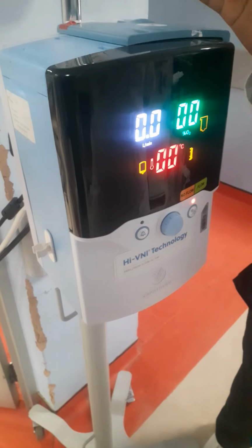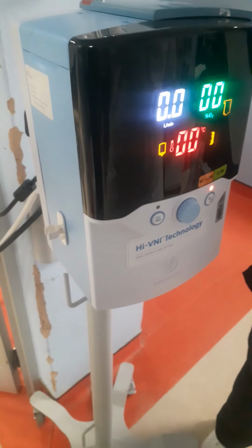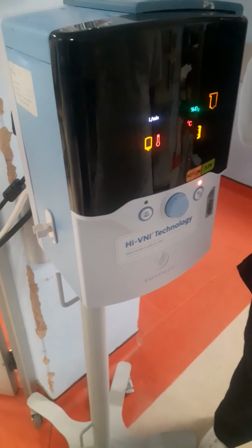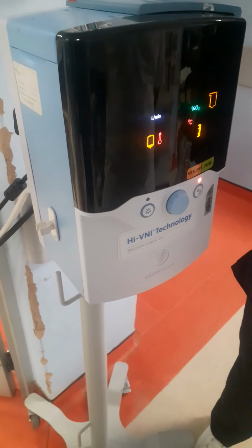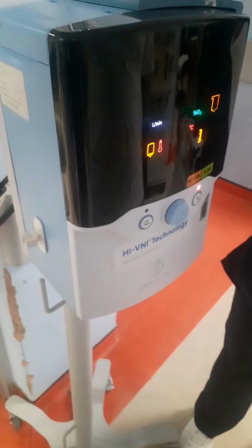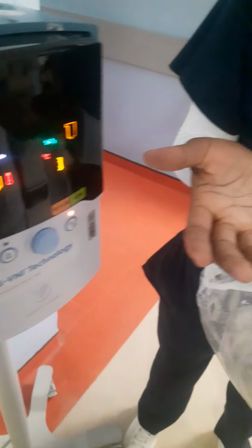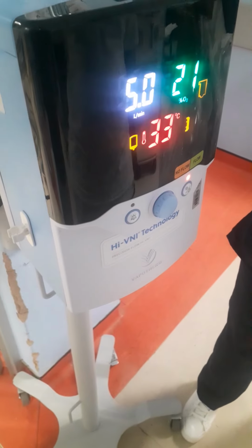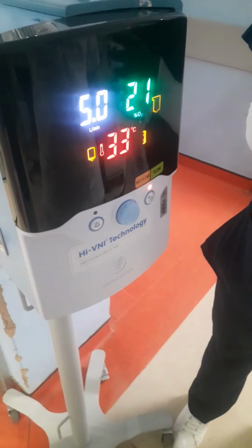We know that there's oxygen assistance like the nasal prongs and the mask. With those, the flow only goes up to 15 from the flow meters, and the air is not warm. It's cold air. Remember when you get cold, you become white and pale? That means your blood is trying to retain the warmth, so that it can retain the blood flow, right?